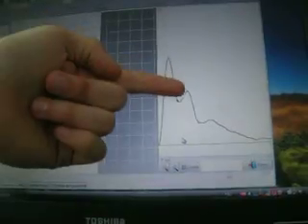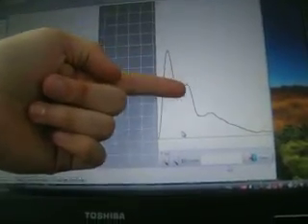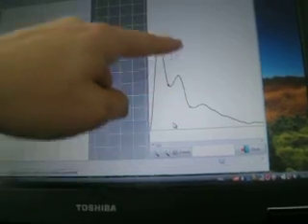This is the first systolic wave, this is the reflected systolic wave, and this is the end of the systole. So these all happen within the systolic period of a heart cycle, and if you have two peaks like this, you can be quite sure that the calculated results are accurate.